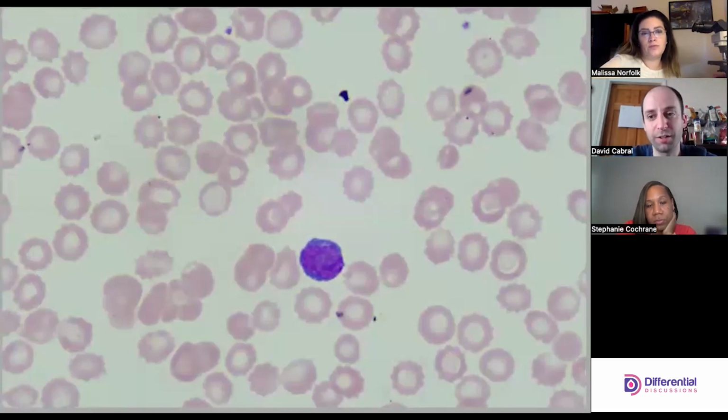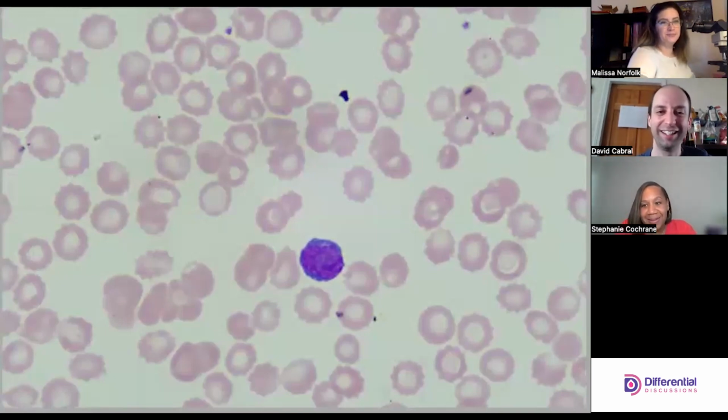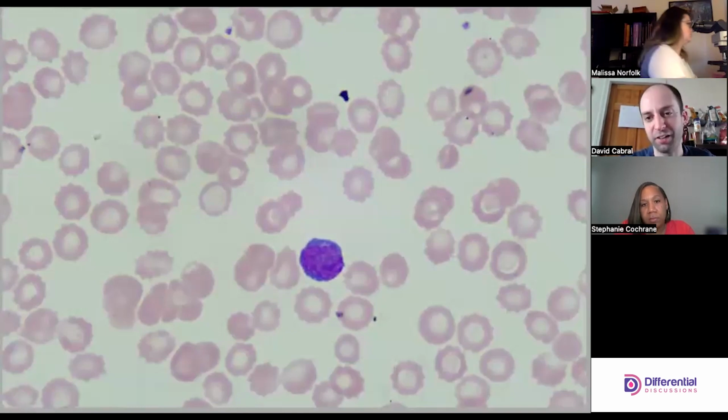Yeah, agreed. That would be the other thing that can complicate pediatric stuff, is that the lymphs tend to look a little less mature generally. So this would definitely be going to pathology review. Yeah, no doubt about that. Especially given the 7-day-old pancytopenia, this should get great care and attention. I think I'm hung up on aplastic versus reactive.